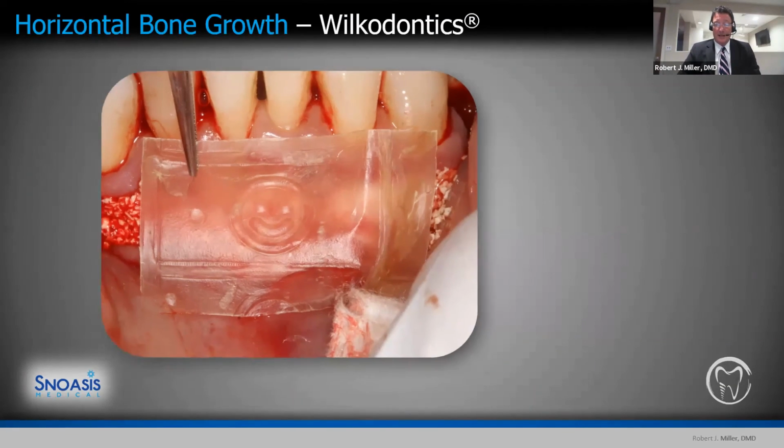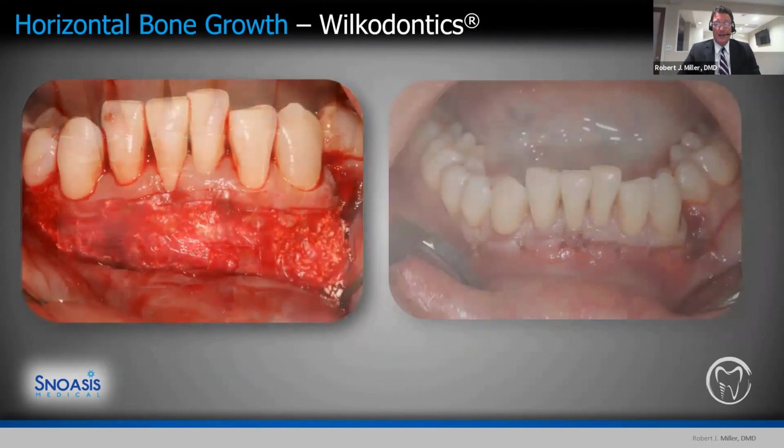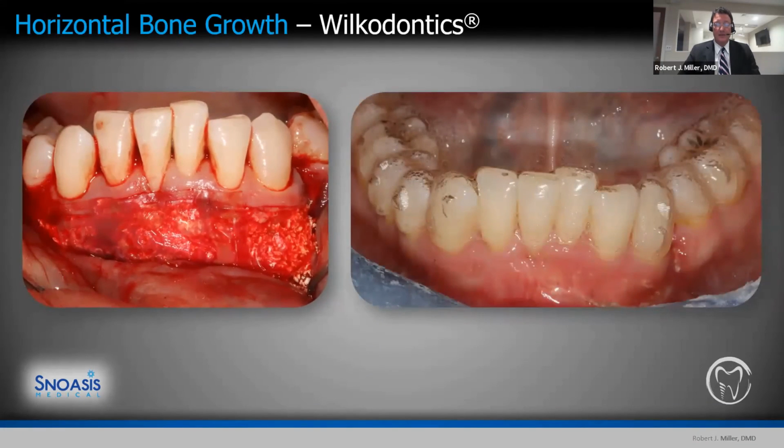So in this case, I placed a piece of BioXclude on top of it. I think because of the size of the surgery, I needed a second piece of BioXclude. And you can see just how nicely that lays right into position. And again, there's no suturing it down. There's no tacking it down. It just adheres to exactly what we're looking to have it adhere to. Again, we look for tension-free primary closure, allow this to heal over time.